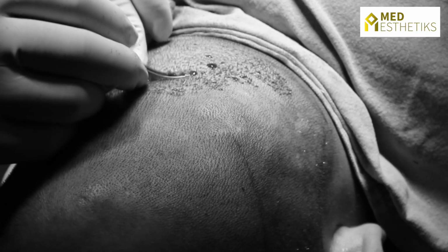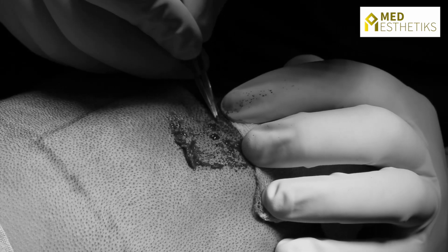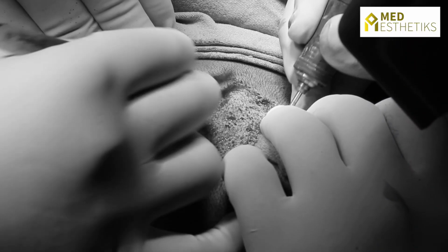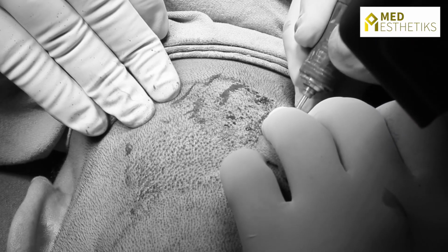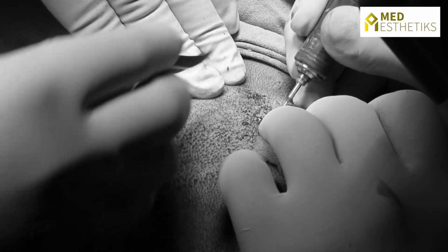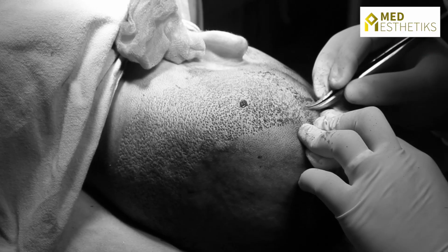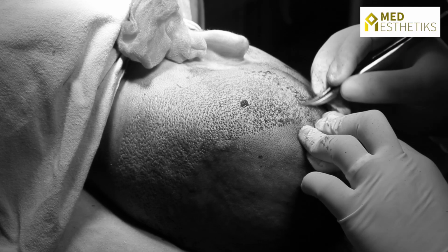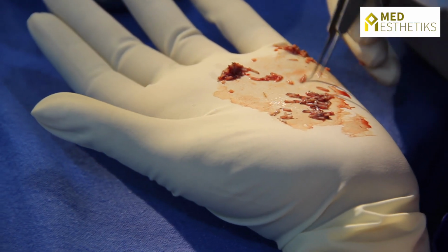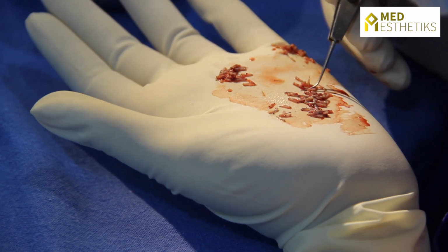These punches are usually less than 1 millimeter in size. 0.7 mm and 0.8 mm are the most frequently used punches, and they are punched at a specific angle. We always keep a little bit of hair above the skin so that we know the direction from where the hair is coming out, and in that direction only we punch, and that ensures that we do not damage the root of the hair. When we make the slits, we always count the number of the slits. That ensures that we do not harvest any extra grafts.